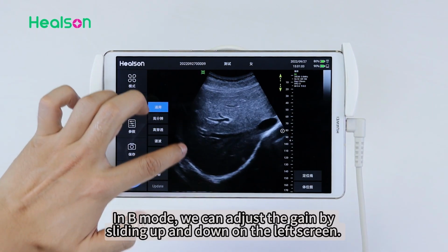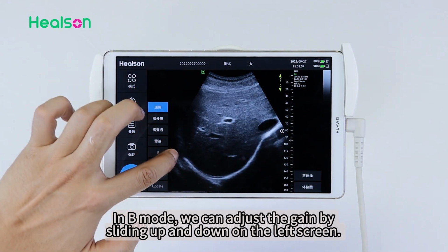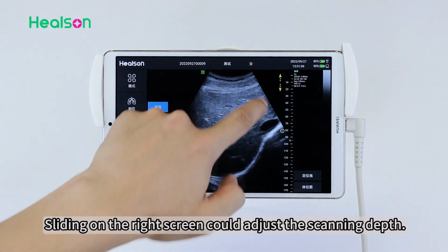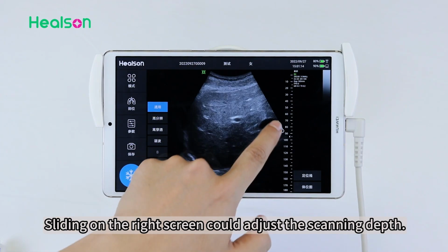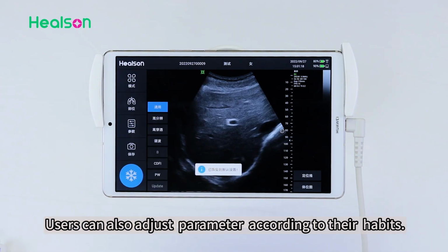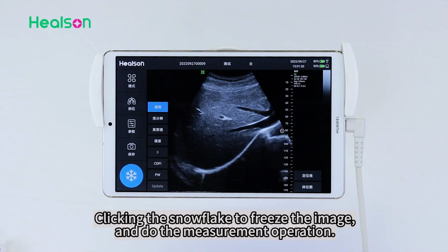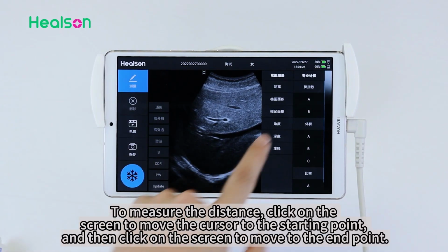In B mode, we can adjust the gain by sliding up and down on the left screen. Sliding on the right screen could adjust the scanning depth. Users can also adjust parameter according to their habits. Clicking the snowflake to freeze the image and do the measurement operation.